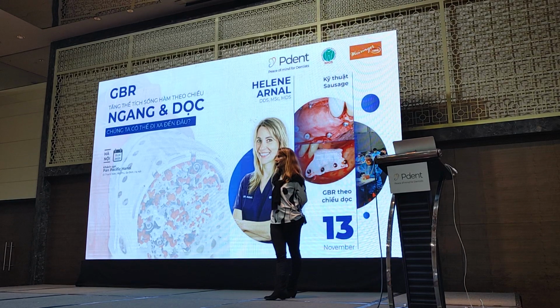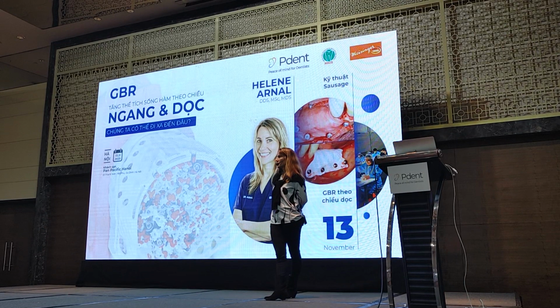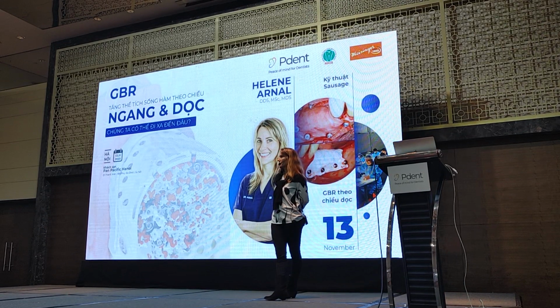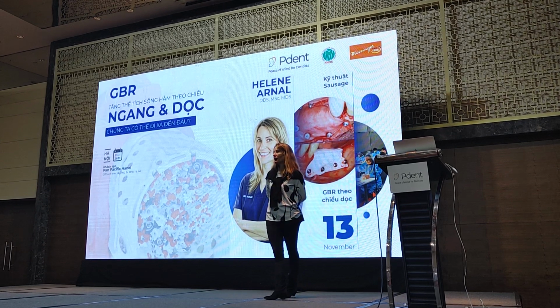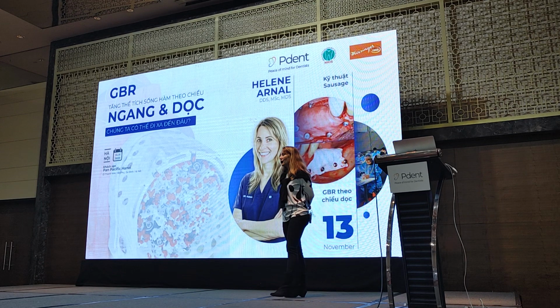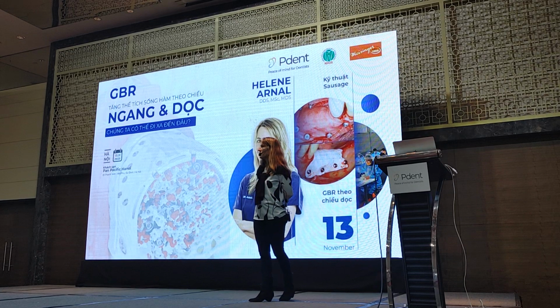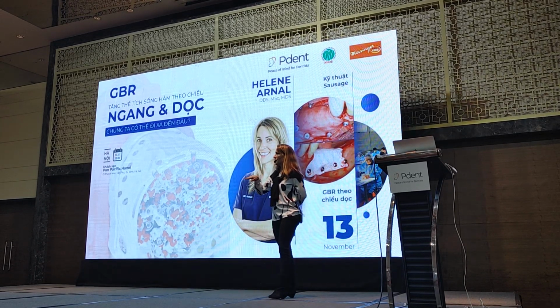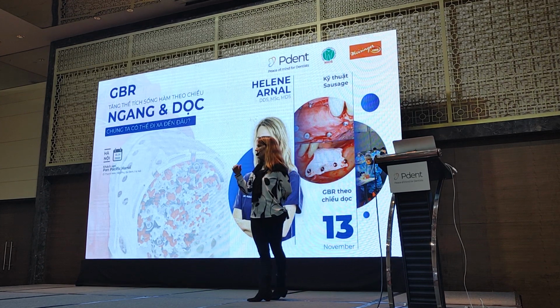I think the suitable question is how to harvest the autograft in the retromolar area so as not to damage the nerve. How to make the incision to harvest the autogenous bone in the retromolar. Yeah. We will do this afternoon, but the main tool, a very nice tool, is provided by Meisinger. It's the trephine designed by Professor Urban. They are step trephines with different lengths. You choose on your CBCT where you want to stop and use the right trephine.